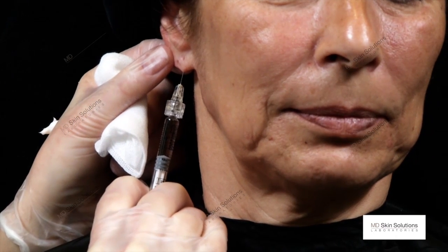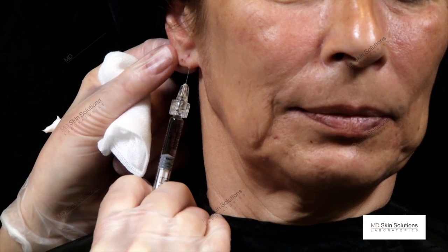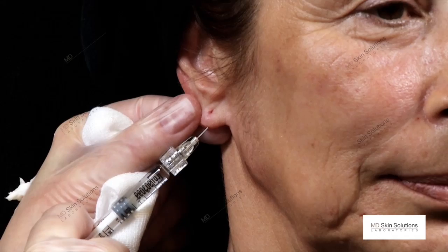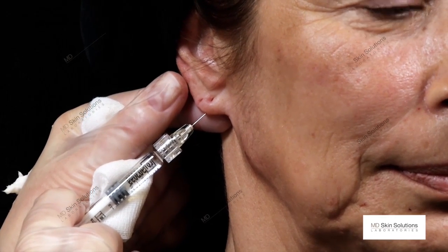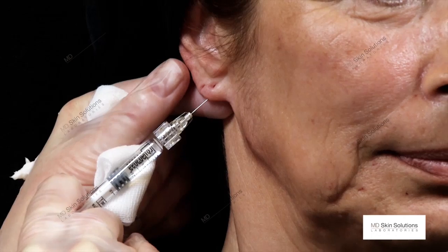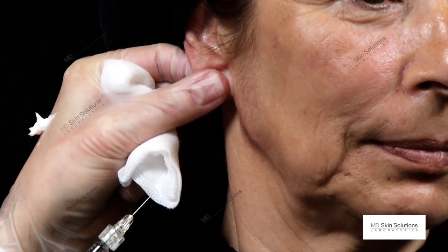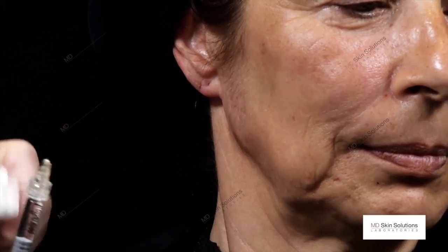I use a 30 gauge needle. I mix the Pluryal with 20% of lidocaine, reshape, revolumize the earlobe in order to get a younger-looking earlobe that holds earrings better.